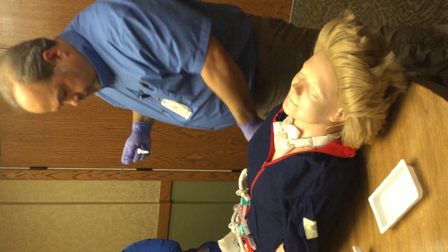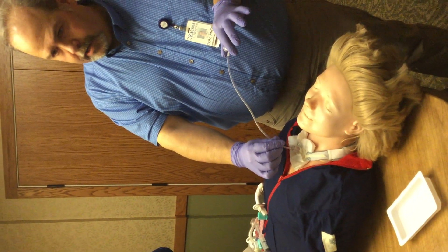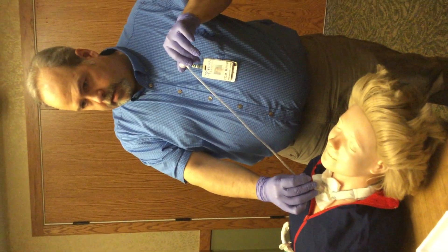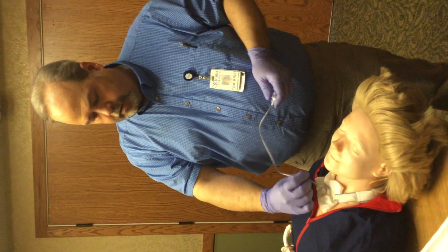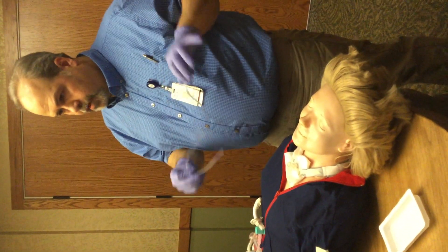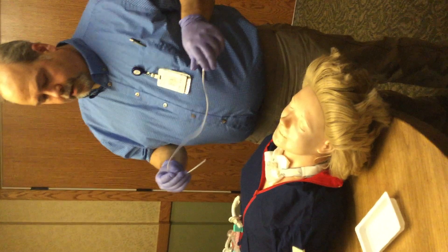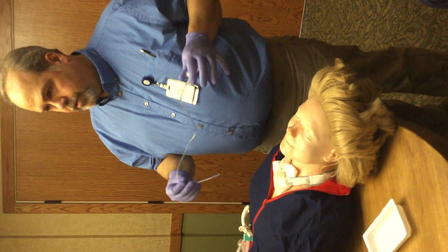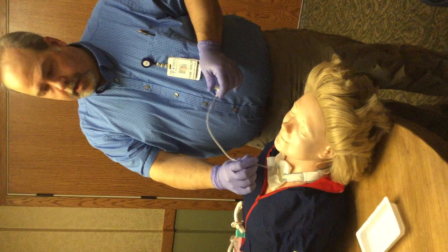With the patient, you can give just a few drops of saline and then go ahead and suction. Use a gentle hand until you hit resistance. Some will cough, some won't. If you get a big cough before you hit resistance, that's fine — just start suctioning on your way back. Usually it's intermittent. Slide your fingers until you get to your tip. Some people just pull straight up and it's easy to bounce into stuff. If you do hit something, pitch it and grab a new one — it's about a buck eighty for a kit. It's cheaper than giving them an infection.